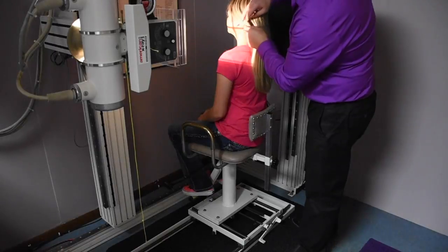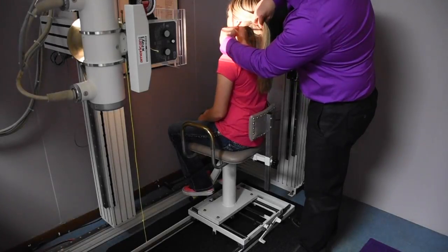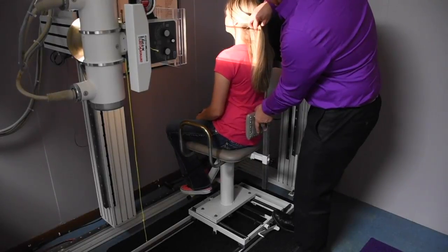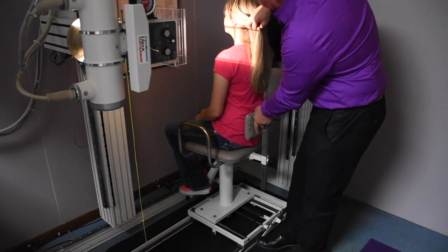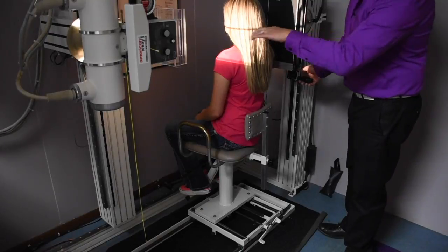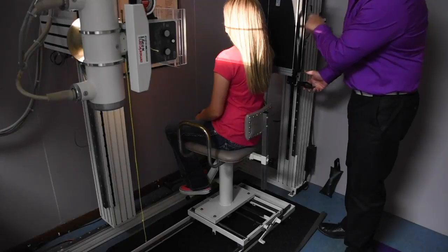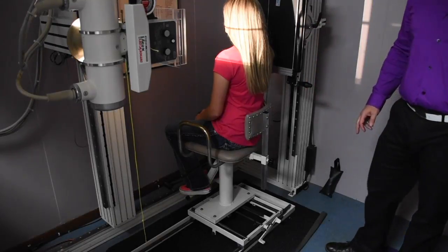Where we want to be — obviously here's the atlas fossa. So I'm going to move the patient forward just a little bit so that way we get the entire curve in there, but right directly over the atlas. Then we're going to line the horizontal mark up with that. And that completes the lateral cervical.